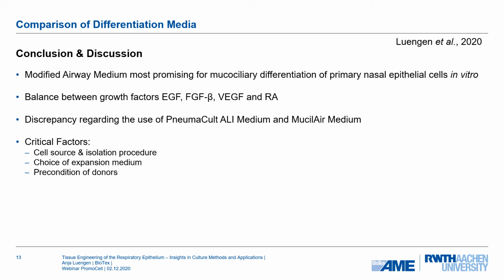Of course, we cannot avoid mentioning the discrepancy regarding the lack of differentiation in PneumaCult-ALI medium and MucilAir medium compared to divergent reports in the literature. These media have been successfully used in other studies. In the end, we cannot answer this question, but we think that the following aspects contribute to the different outcomes.